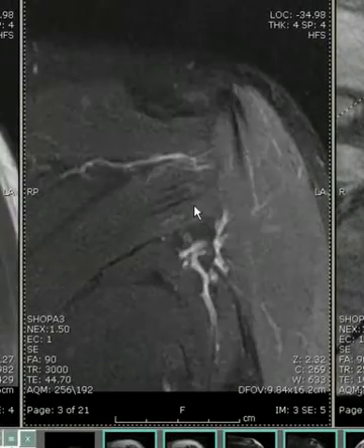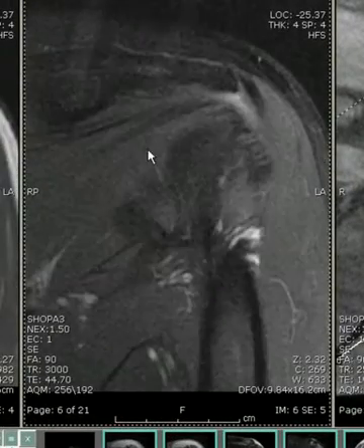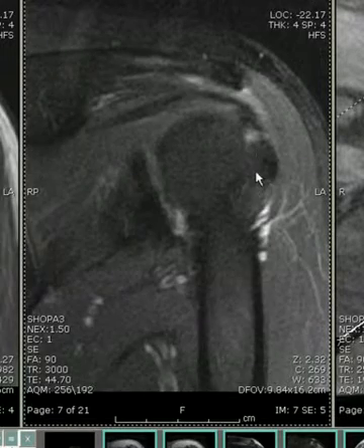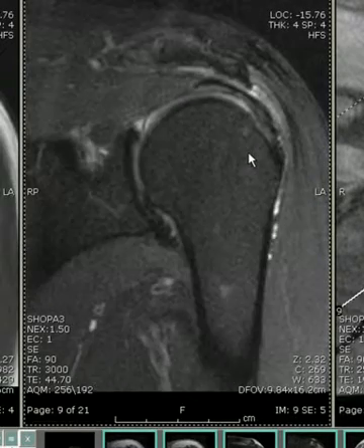Coronally, we will begin most posteriorly, and we can see our infraspinatus tendon nicely attaching to the region of the footprint to bone.